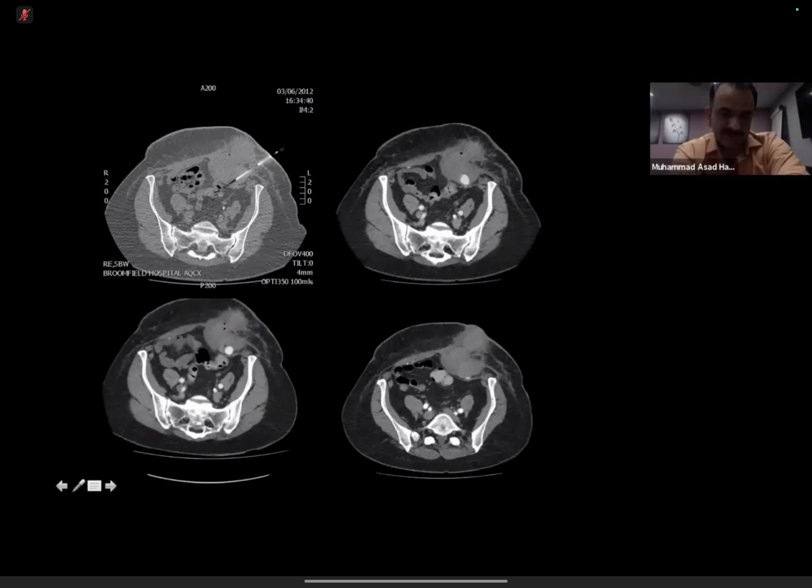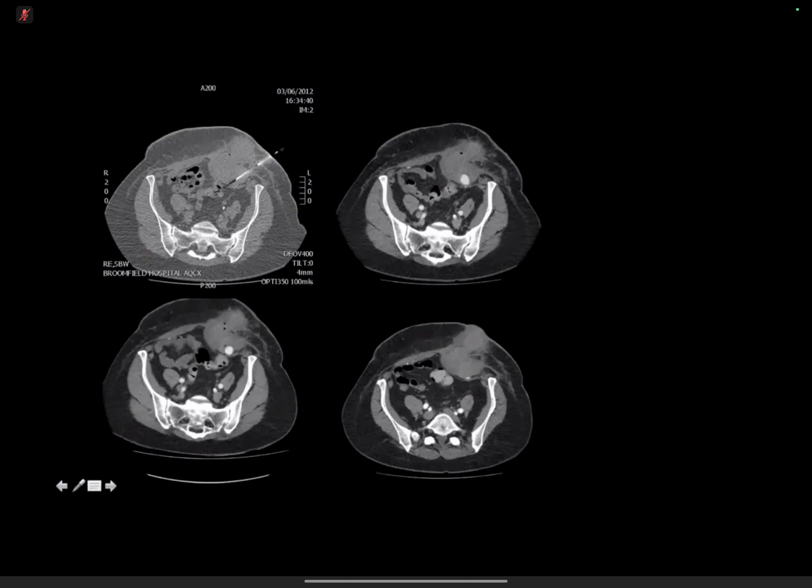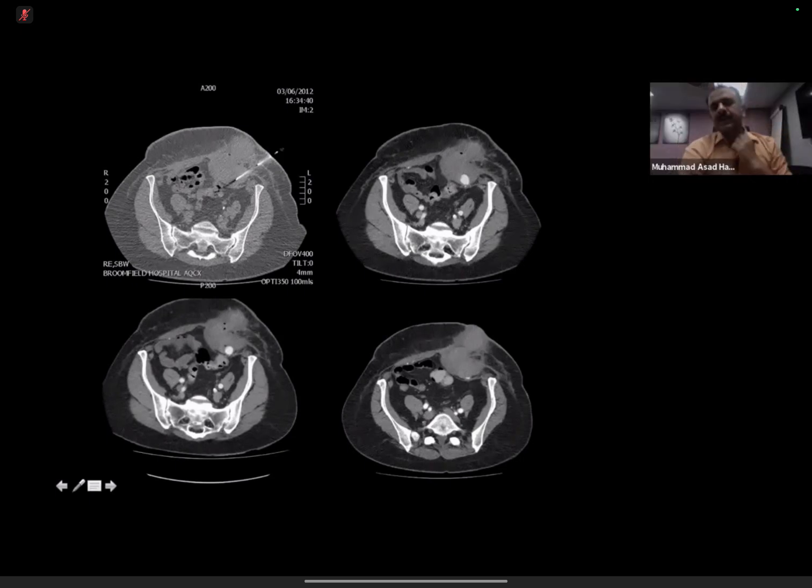I'm trying to guess the origin of this vessel, but maybe it's an injured inferior epigastric artery. Good. So a needle biopsy was being performed that has injured the inferior epigastric artery. Okay. And this is the inferior epigastric artery pseudoaneurysm. Okay. In addition to embolizing, are there any other methods of treating such pseudoaneurysms?